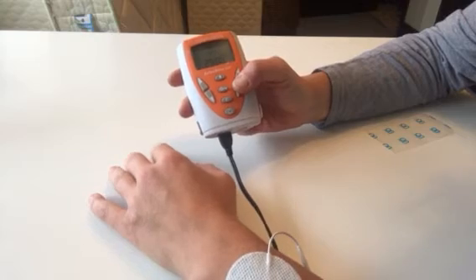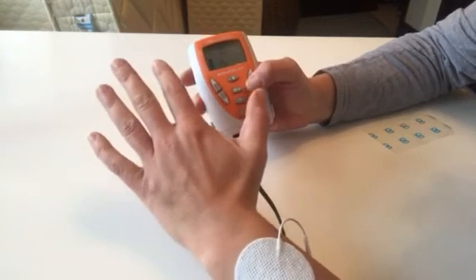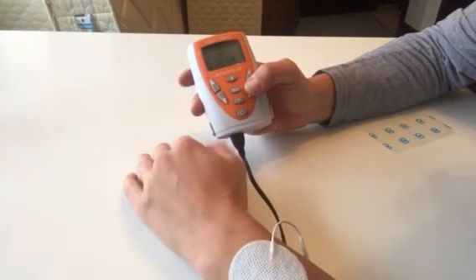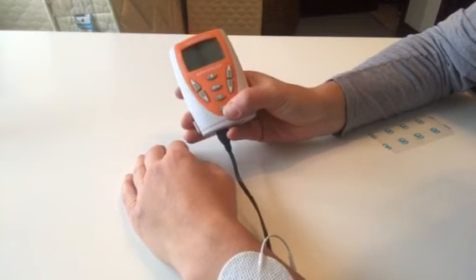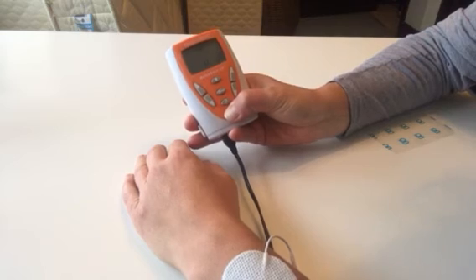If I want to resume the preset program mode, I'll just press the intensity button once and it will go back into the timed program. To pause, press the power button. To turn off, press and hold the power button.